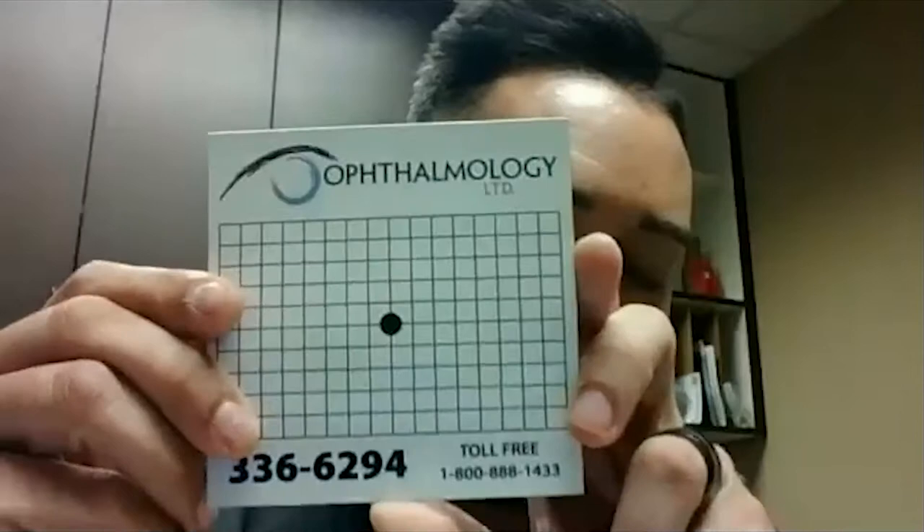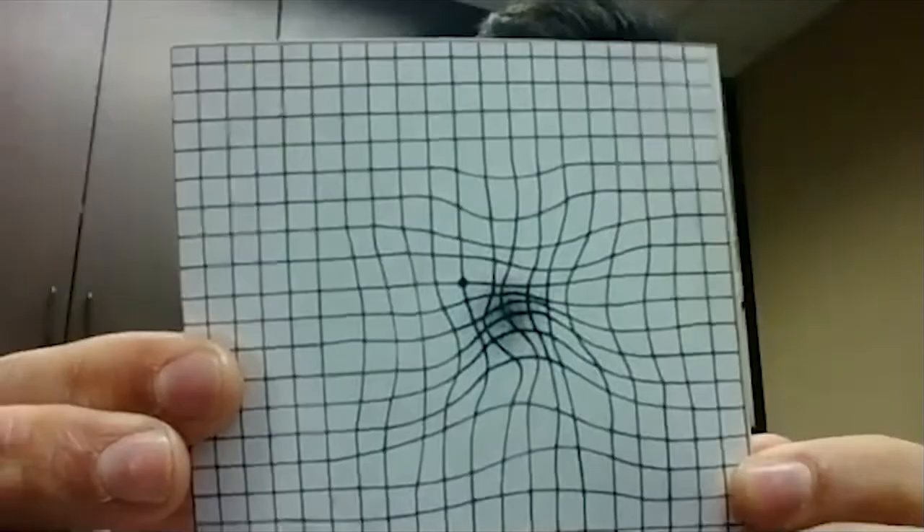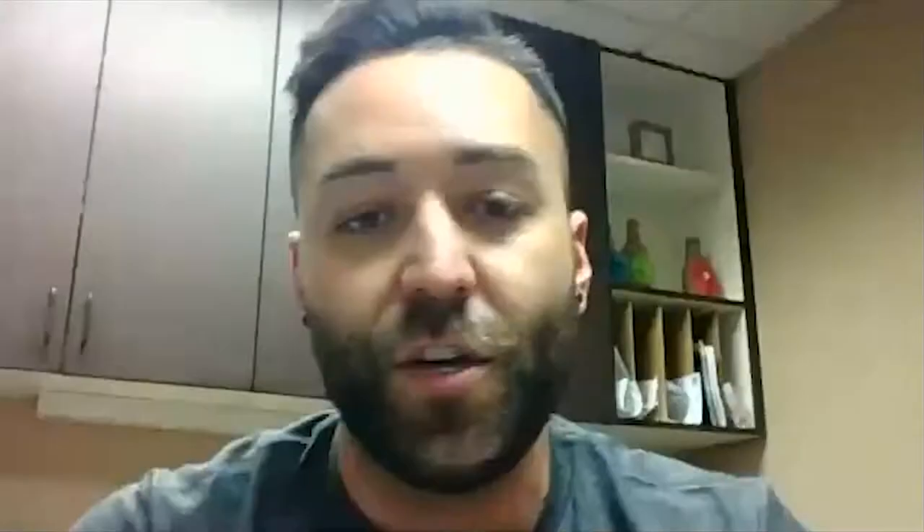Usually when they come in, they have had changes in their eye when we dilate them. So this is what it looks like — it's kind of like a line graph. That's what it's going to look like to a person that has normal, healthy eyes. However, if they are having changes to their vision, this is just an example of what it's going to look like. There may be missing pieces, distortion, waviness. And that's just going to be an indicator that there's something else going on with their vision or with their eye.